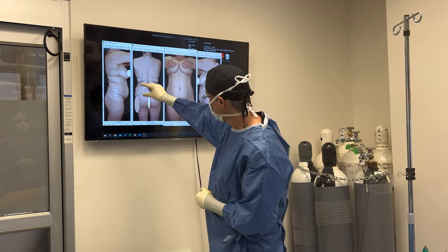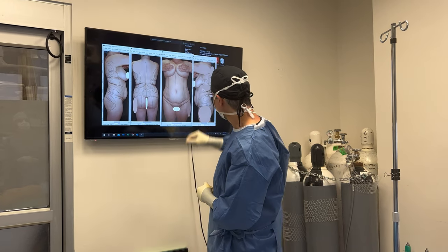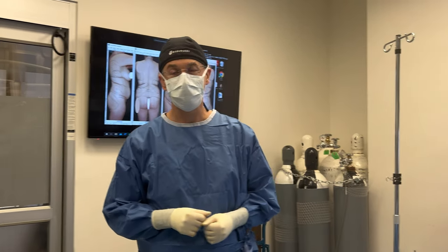So we'll just liposuction the lower abdomen, love handles, and flanks, and we'll do the rest in front of the tummy tuck when she's recovered fully.